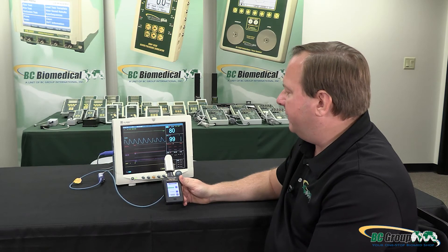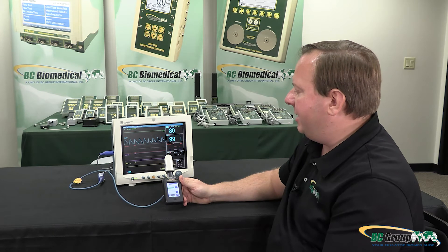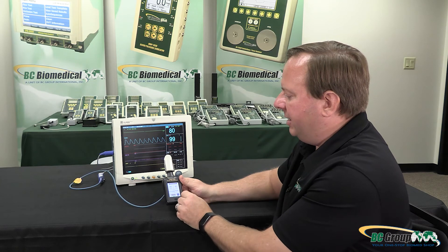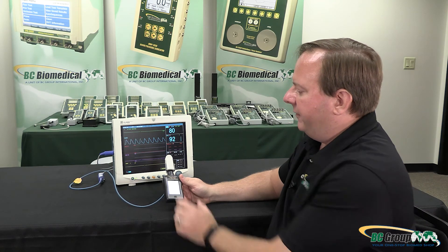One thing to note: if the readings are off a little bit it may be because the wrong manufacturer is selected, which would affect the R curve that we use for simulating the SpO2. So that's one thing to look into if you're having any problems.